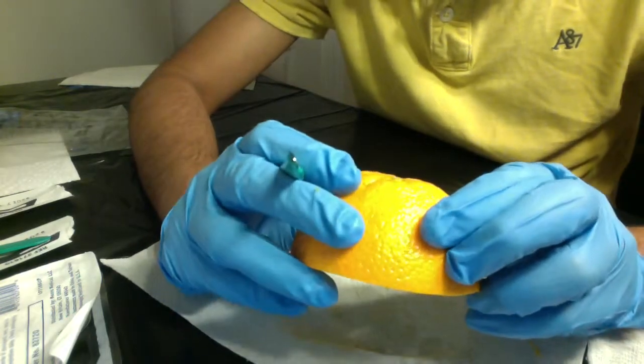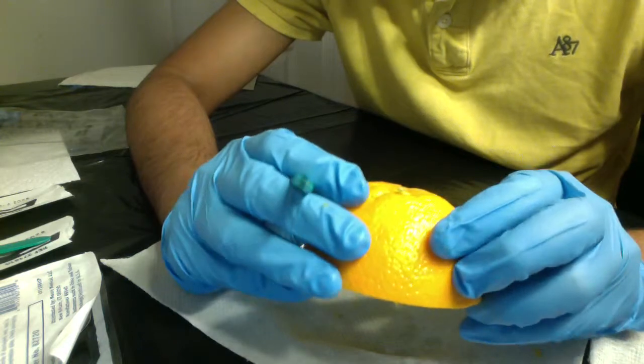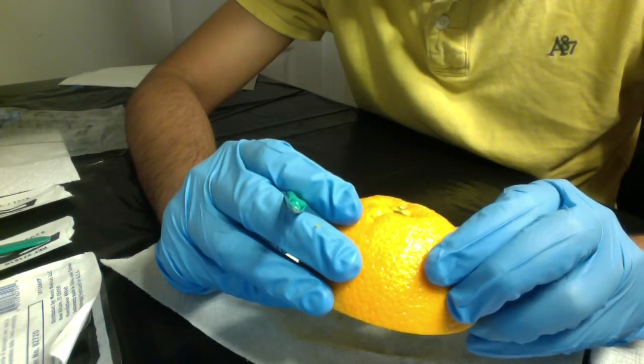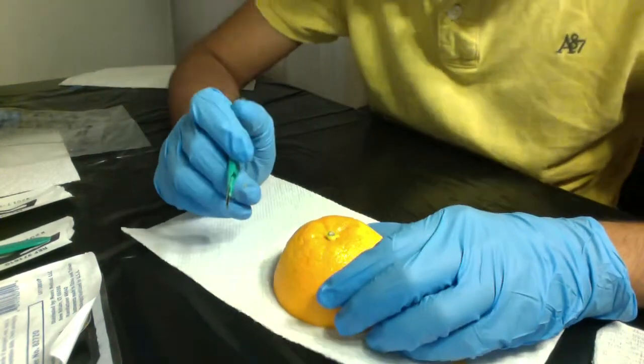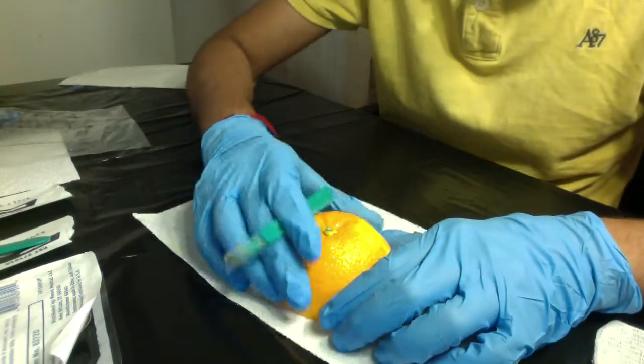Now, I was trying the cross-hatching technique yesterday. It was a little deep, and I think I improved over yesterday, and just getting a good grip of the scalpel and putting good cuts throughout the orange. So this was the cross-hatching technique.